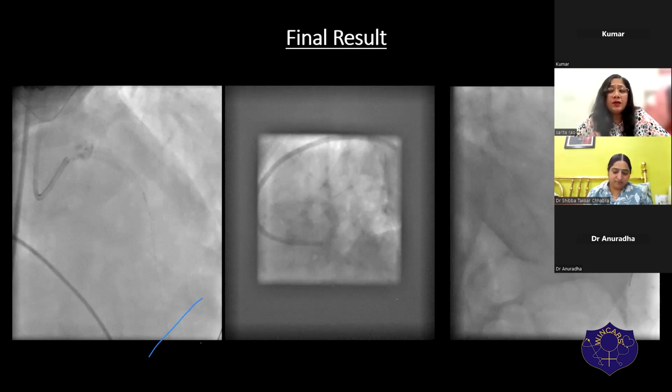There's a very big if, because that would probably remain stable. But if it did not, for me, that's open. Also, I did find a landing zone. And since I was using imaging, I was very clear that my landing zone was good. So I did find a landing zone, and I preferred to keep it there.